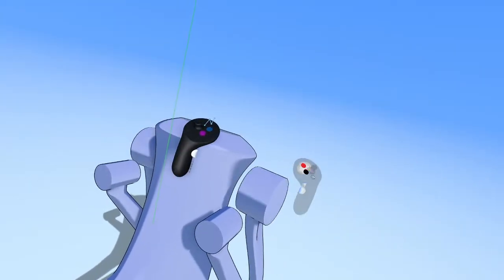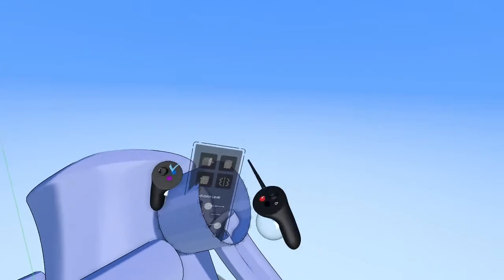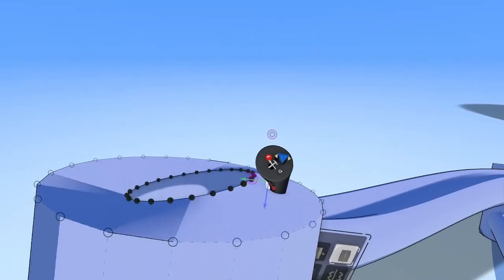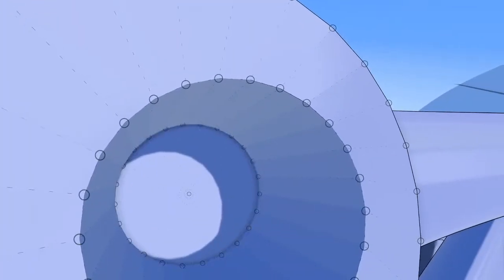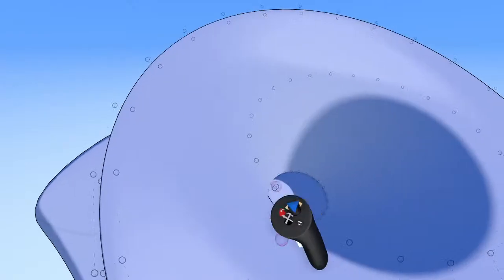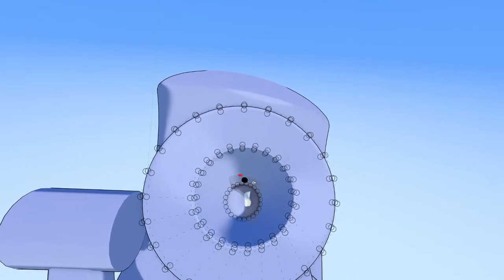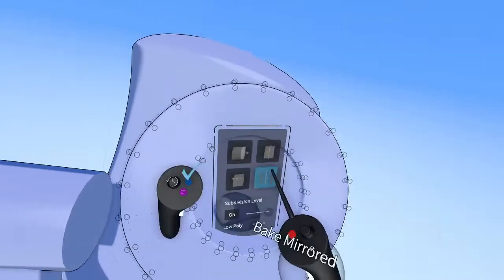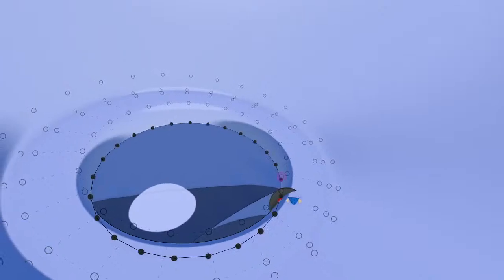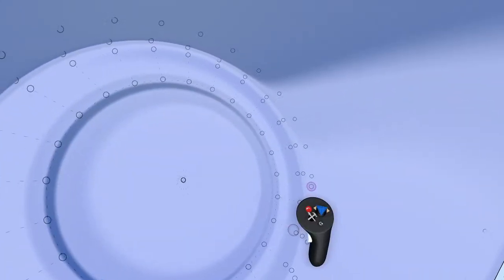Okay, so for more detail on the shoulders here, we can take that, and now that we have our general shape, we can convert it to sub D here, and do a bunch of stuff on top of this. Subdivide that, add some edge loops. Maybe this is like, I'm not sure what I'm doing for this, but maybe this is where it bolts down. I don't know, looks kind of cool.